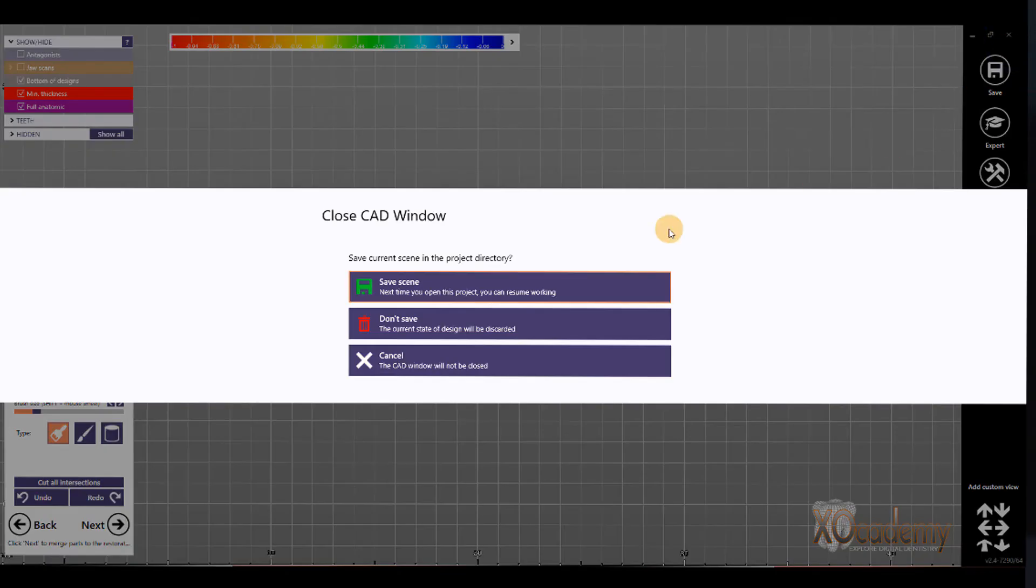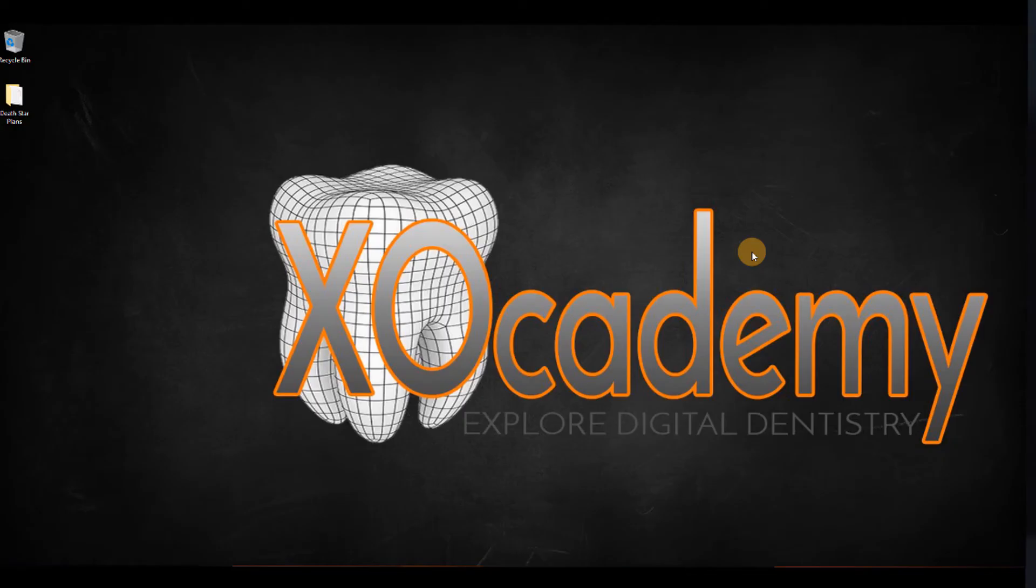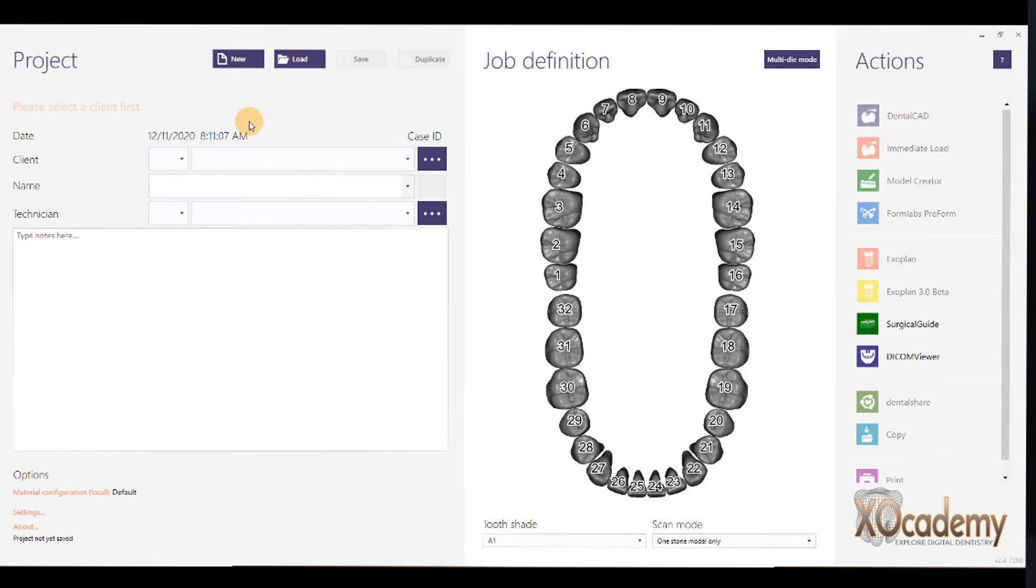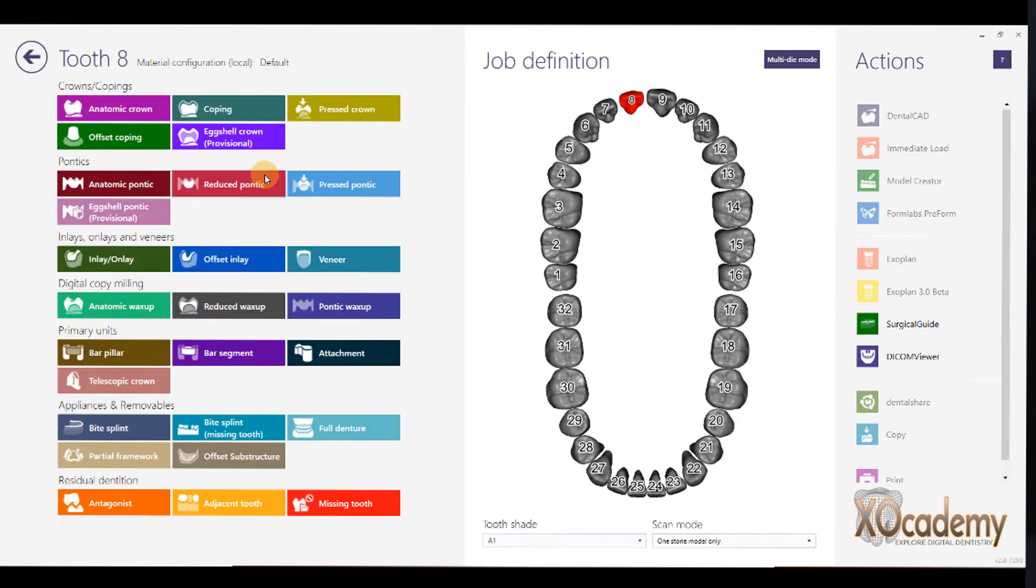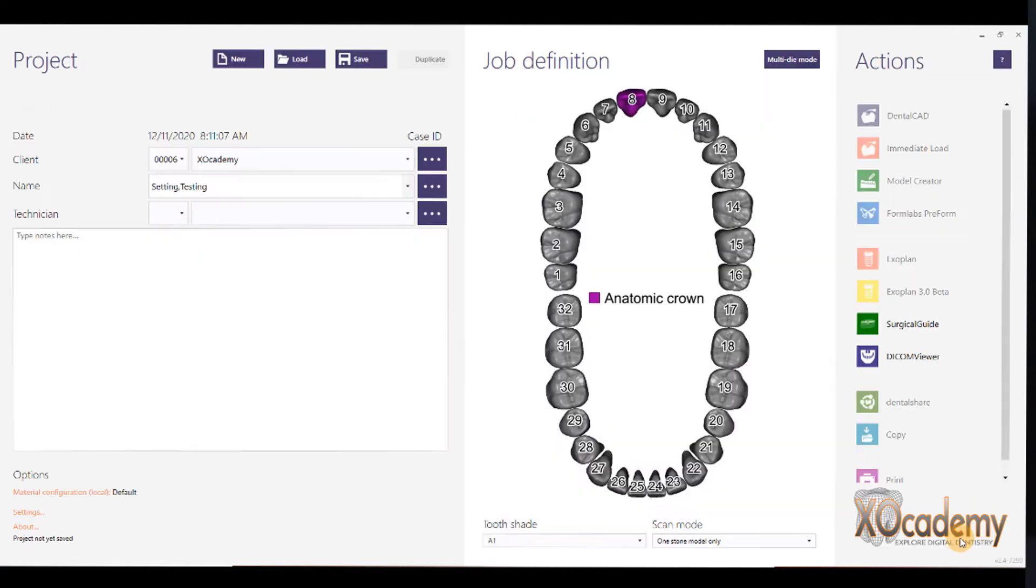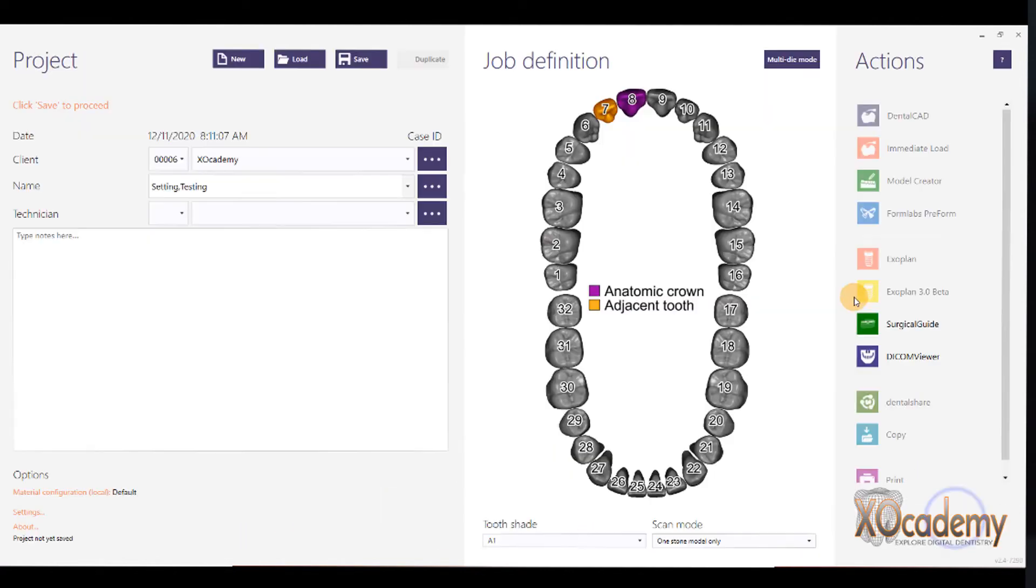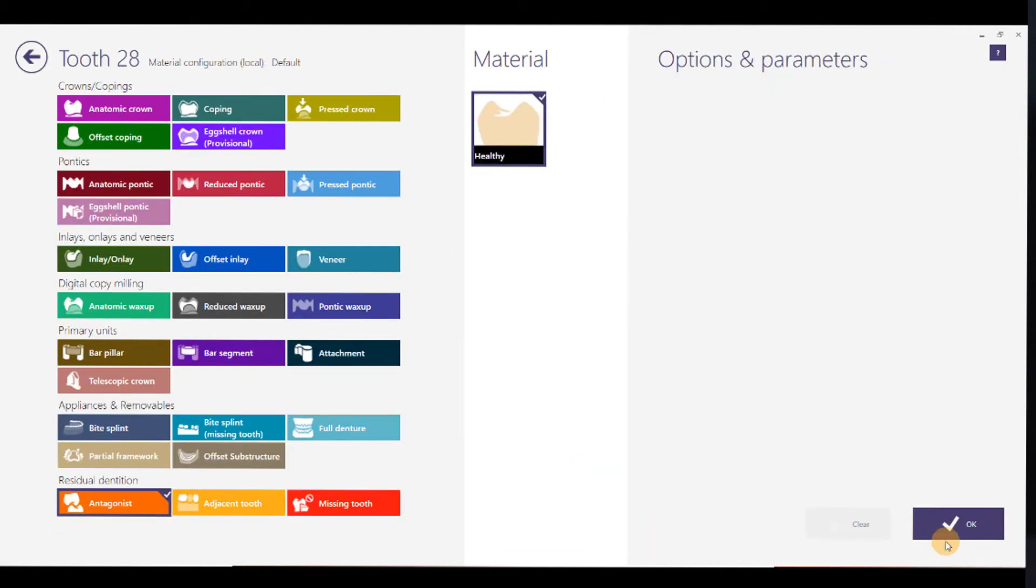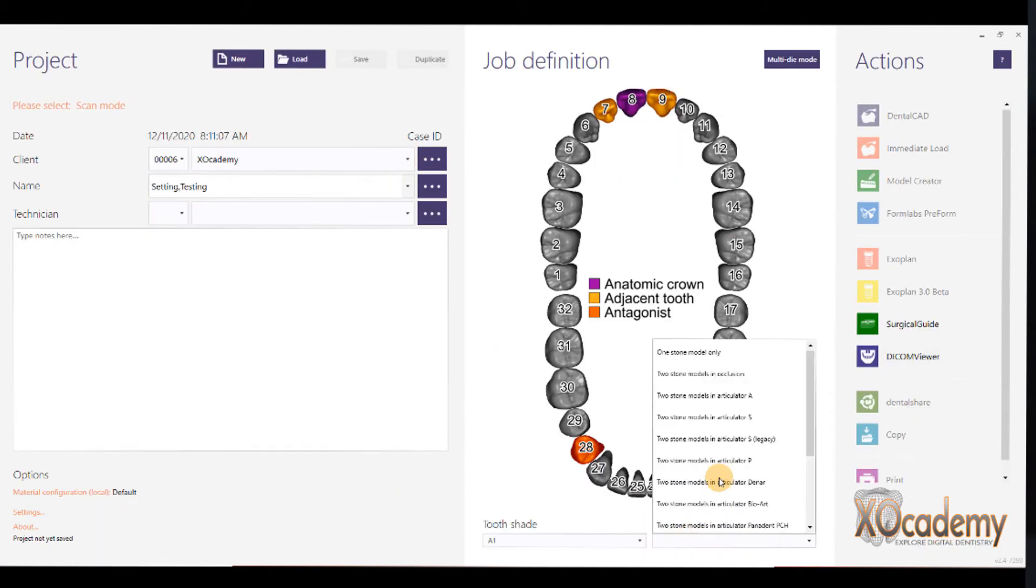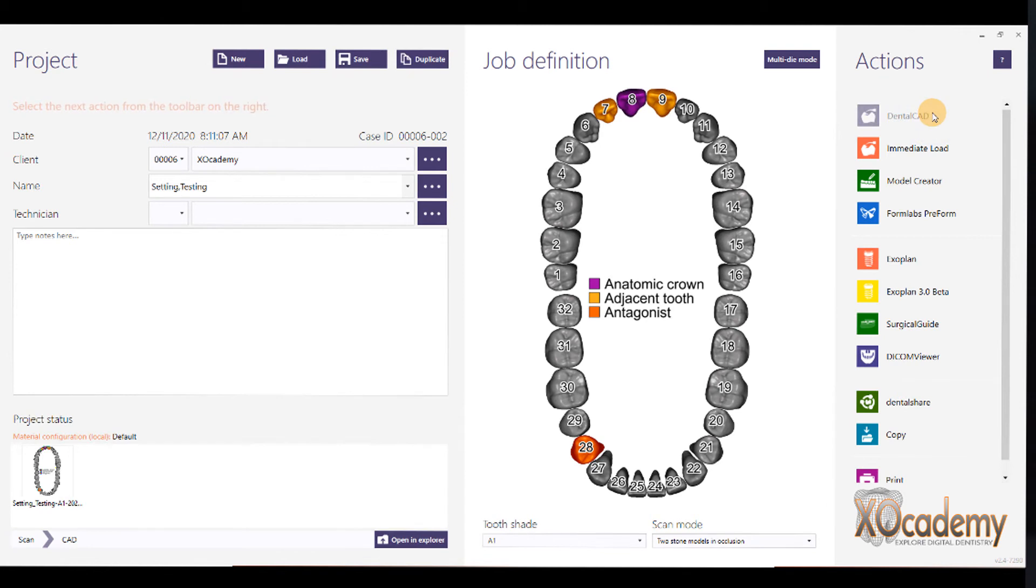And, so now we've saved it. I'm not going to save this, and I'm going to exit out of DentalDB. Let's start DentalDB again with this new XML file, and we'll show you what the changes are, or how they're incorporated. So, I'm going to load our setting test, and we're going to make crown number eight. And we'll start DentalCAD.